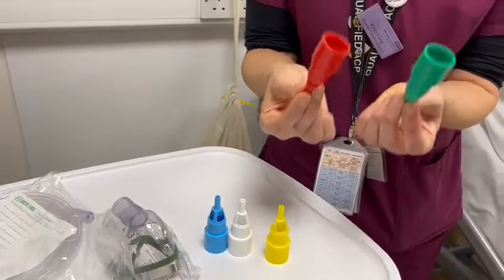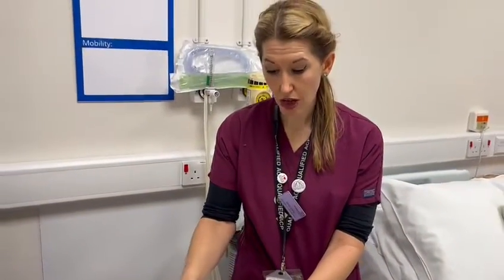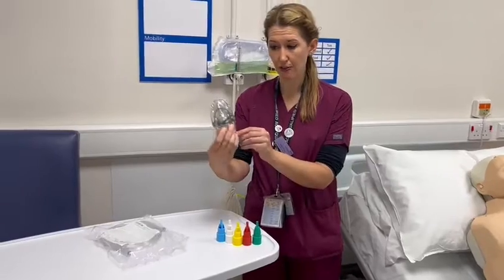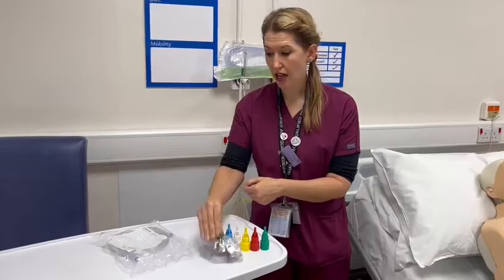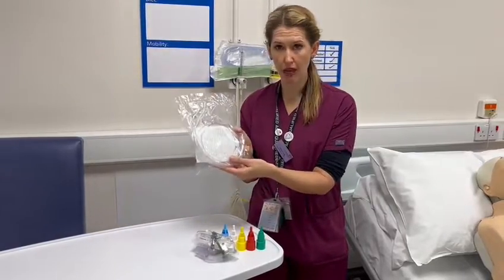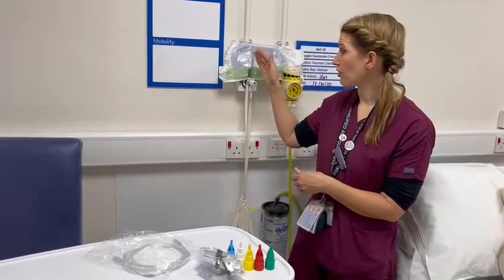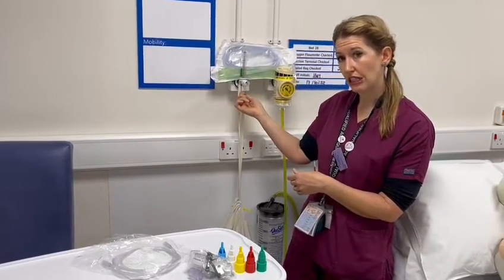Once you're getting up to 40% and 60%, it becomes very drying for the patient. In order to commence them on the Venturi, you are also going to need a mask — just a simple face mask — which has a clear port on the bottom, and you're going to need some oxygen tubing. You'll also need to make sure that when you come to your oxygen port, you've got the right nipple device on the end of it so that you can connect the oxygen.